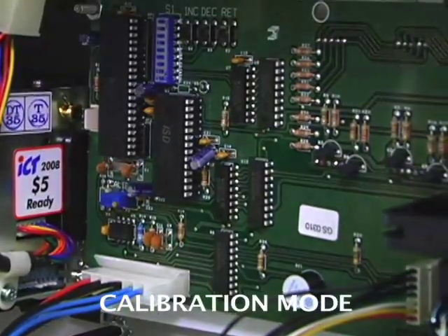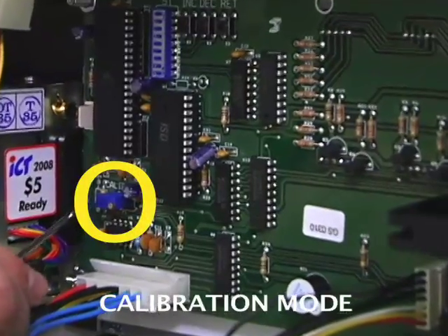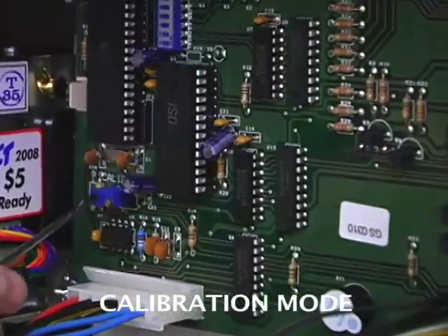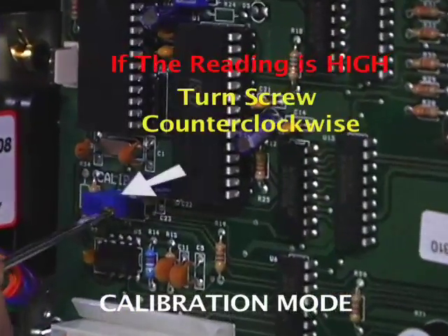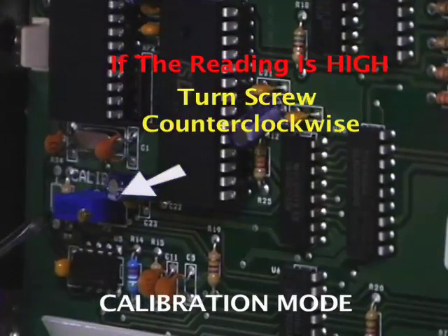To adjust this, there is a brass screw located on the blue rectangle. We want to turn it counter-clockwise if the reading is too high. We will do that one full revolution. The screw is sensitive at times, so you may need to do this several times to get it exact.